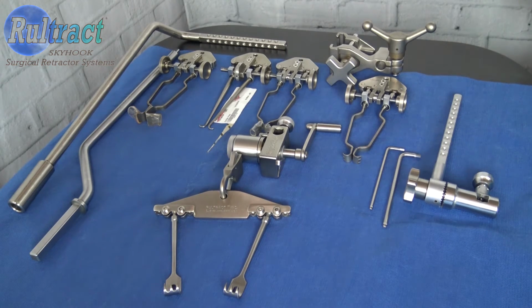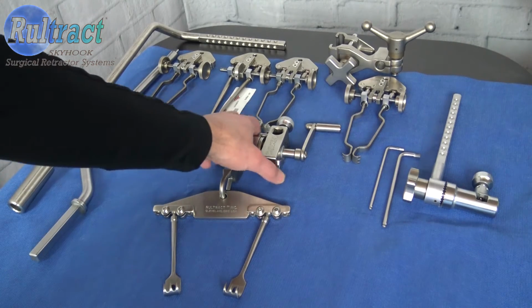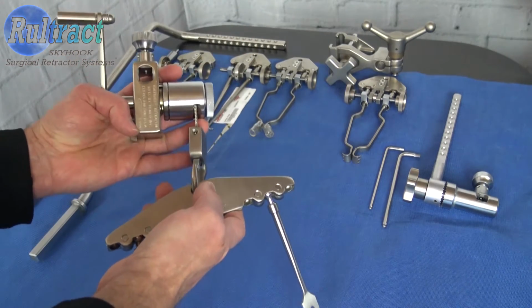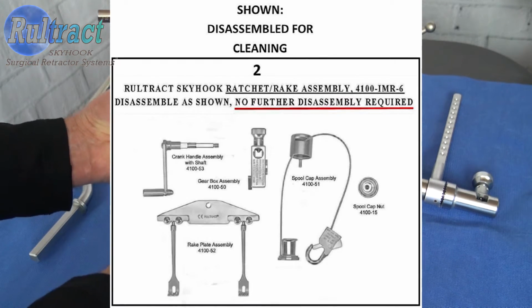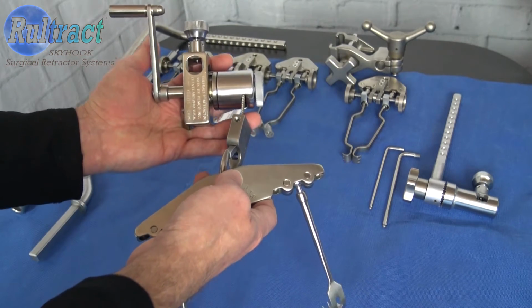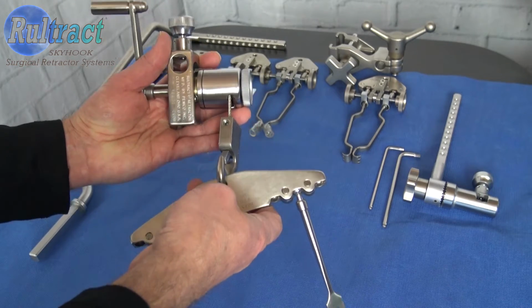My name is Philip Rulo with Rultract, and what I'm going to do is walk you through the cleaning and sterilization process of the equipment that you just received from Rultract for an upcoming case. The first thing that we're going to want to do is to disassemble our Rultract Ratchet Rake assembly. Now this piece of equipment here has to be disassembled into 5 pieces for the cleaning process and then reassembled again to look like this for sterilization and use by the OR. So what we're going to do is disassemble this into 5 separate pieces.